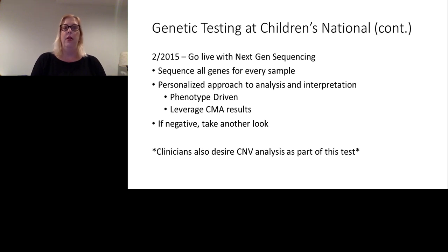This is especially important in our patient population, as approximately 5% of all microarray results in our laboratory have greater than 2.5% areas of homozygosity consistent with consanguinity. Additionally, if testing is negative, we allow the physicians to have a free second look, which minimizes cost and analysis time in the lab, in hopes of also decreasing the number of VUSs that the physician receives on the report.